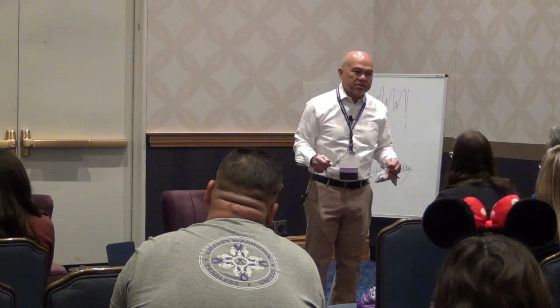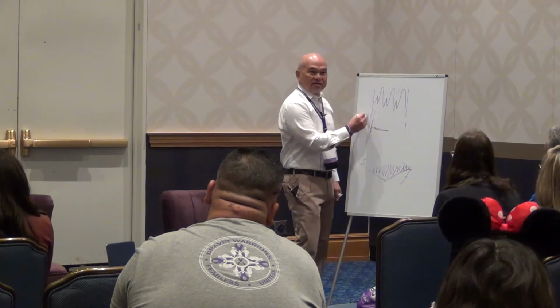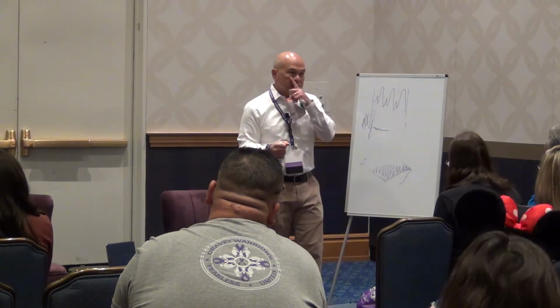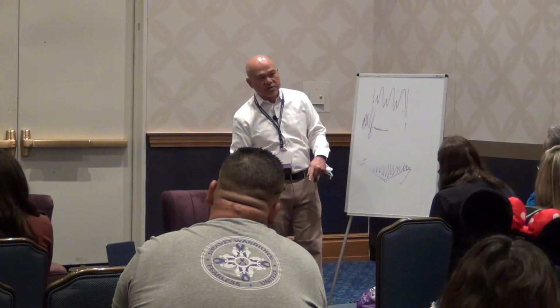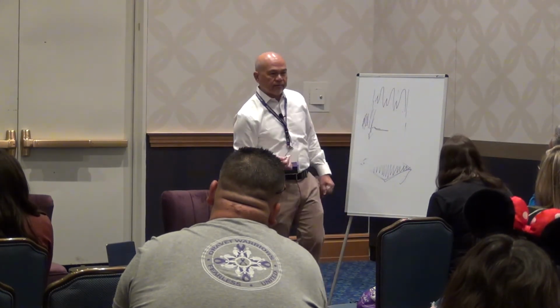That's a good question. If I do this, I just move, it's not a seizure, it's going to create this thing on EEG. But the movement is at the same time as the EEG showing the same abnormality. So the spike needs to come before the jerk, and there's usually a 100 millisecond lag. So once we see the jerk, she's already been in the seizure.